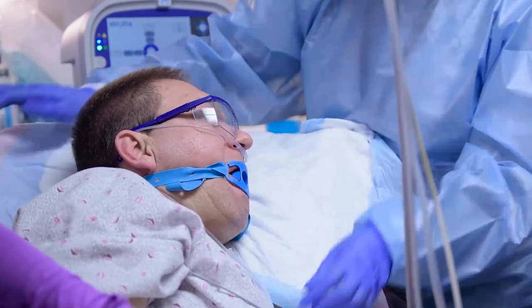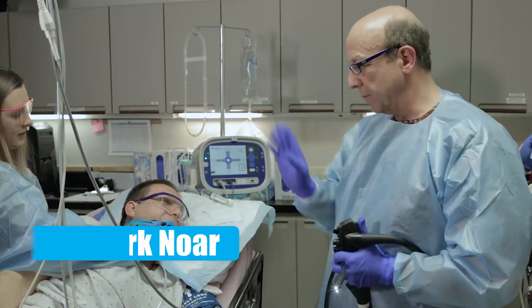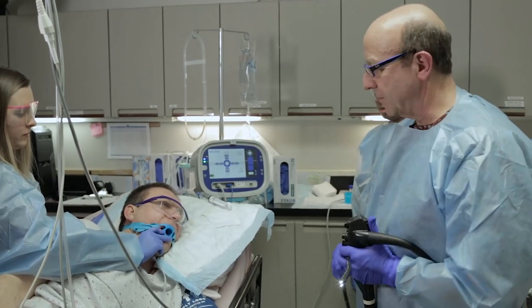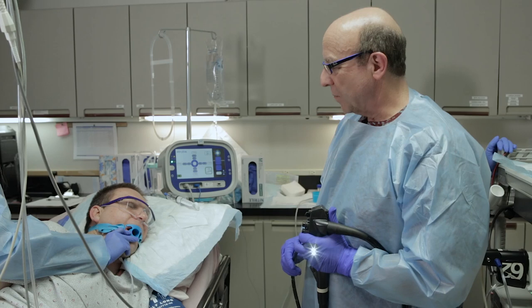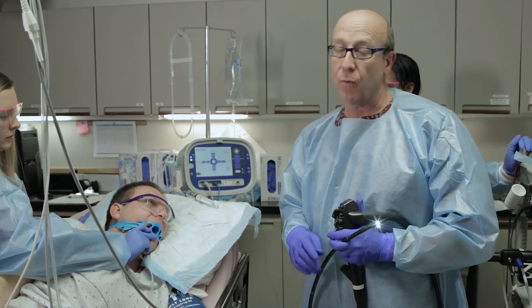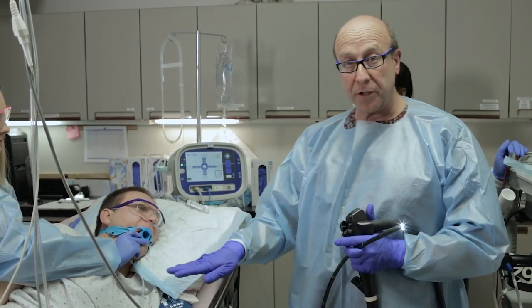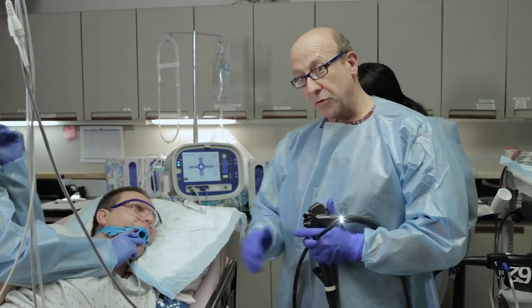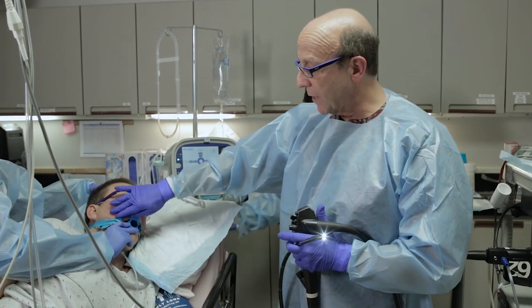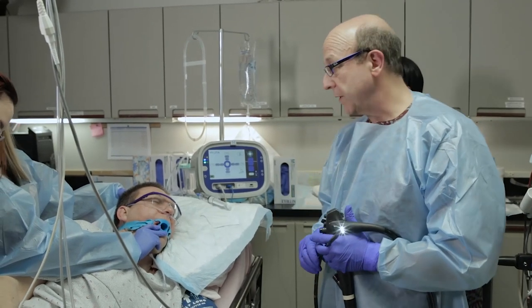We're getting ready to begin the procedure. The most important thing is the team — anesthesia, nurse, technician, and physician — and positioning, positioning, positioning to avoid any potential complications. The number one complication could be aspiration, however we make sure the patient is positioned at a 30-degree angle so we have gravity to help keep water down towards the stomach, and the head is positioned back in extension to facilitate passage of the endoscope and keep the airway maximally open for breathing.